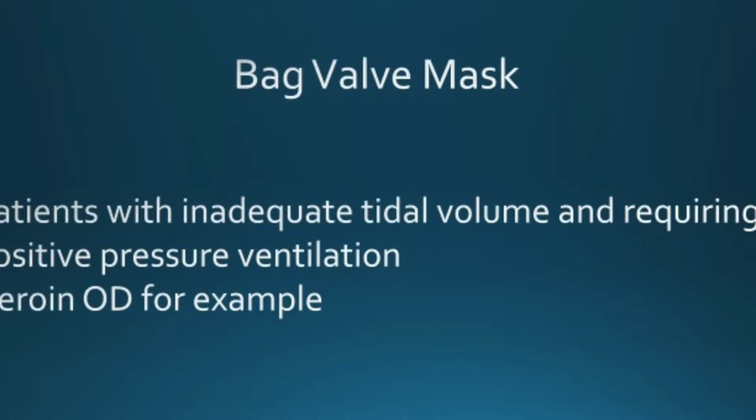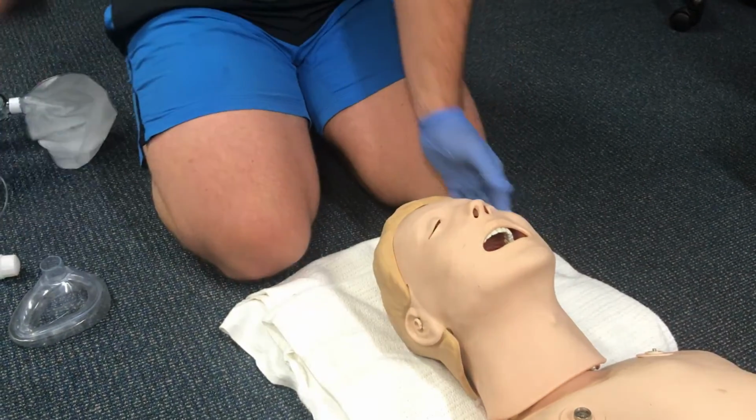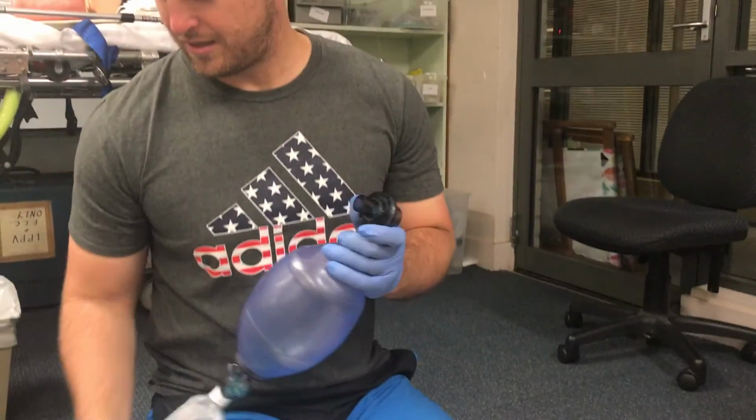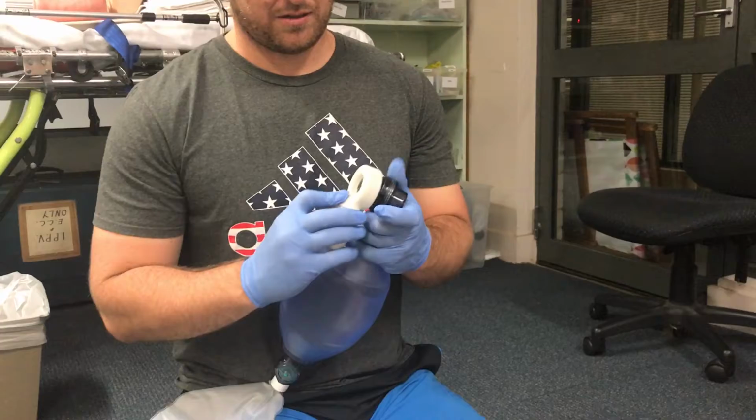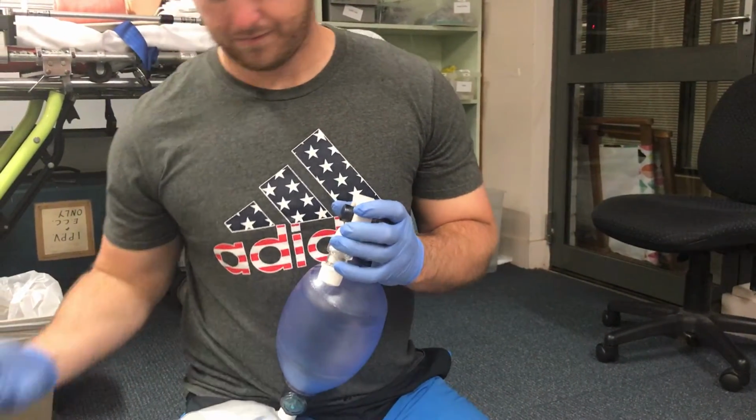First, I place the patient in the optimal position, the sniffing position, with a towel underneath their head. I grab my Laerdal bag with the reservoir bag attached already. Then I place the PEEP valve on, set at 5 centimeters of water.